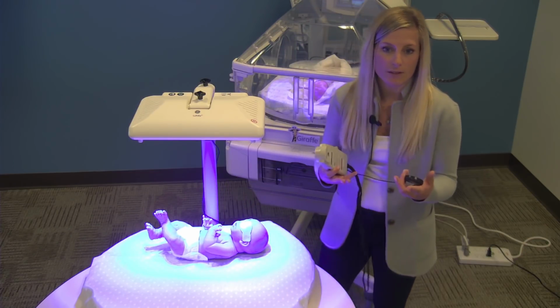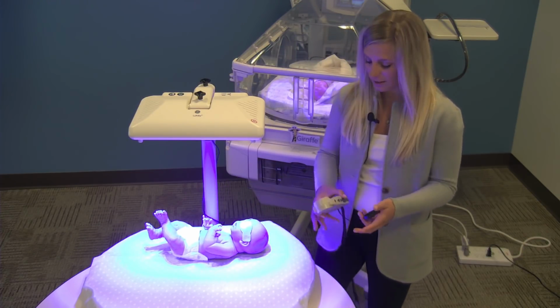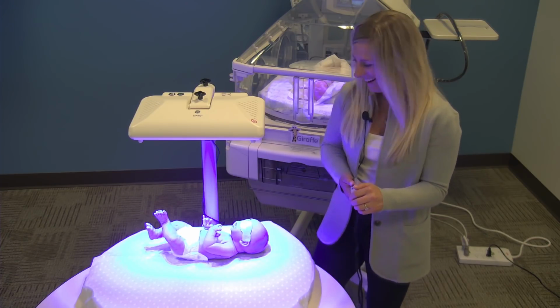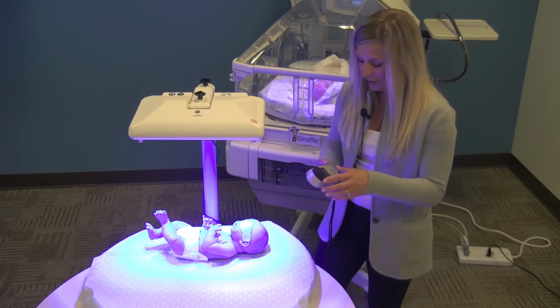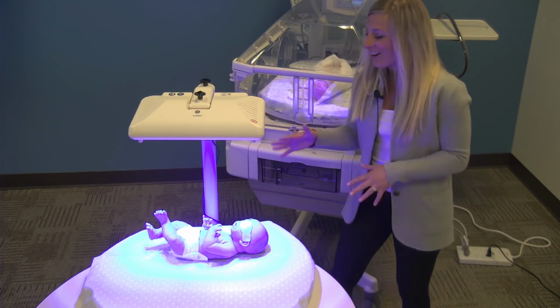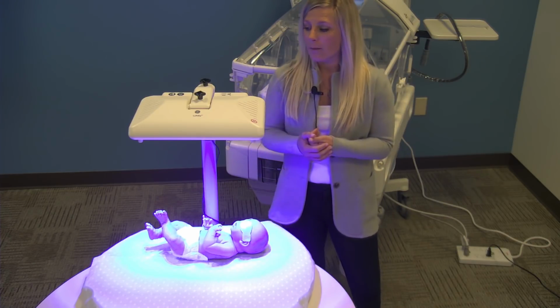And now if I was a mathematician, I would tell you what the average is. And otherwise, you can just check my math on your own computer. Yell it out if you want to. If you're a mathematician, I welcome that kind of brain. All right, so that is how you check the irradiance of the Lullaby.